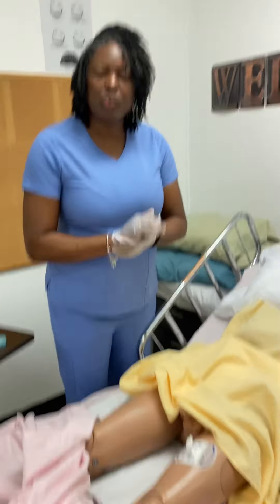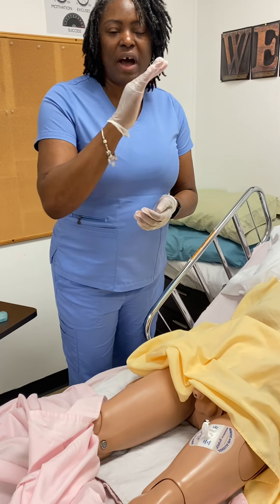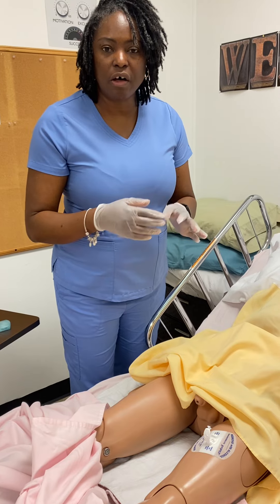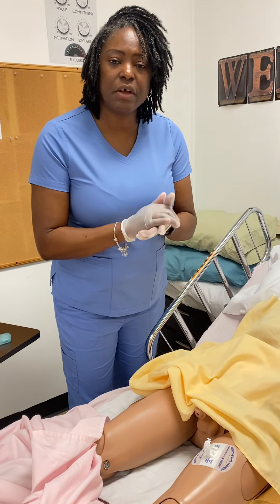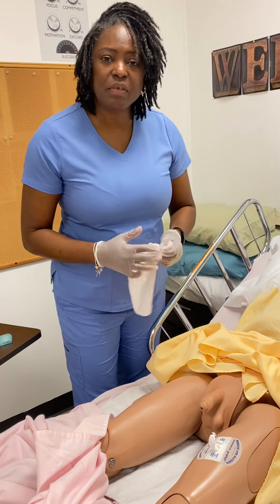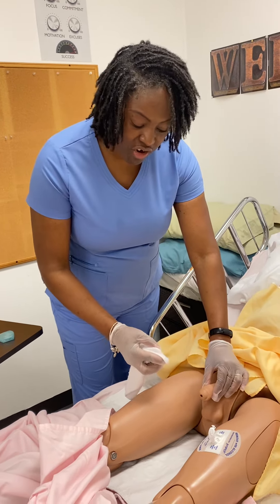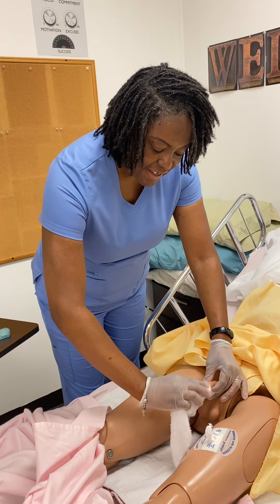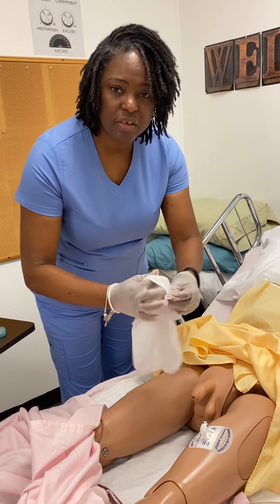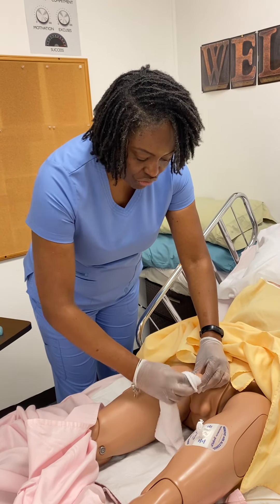So we know when we do women, we wipe from front to back and we always use a different area of the cloth. For men, perineal care is just as important. If I was bathing a male, I would have to retract the foreskin and clean around the penis. Use a different part of the cloth as you do that.